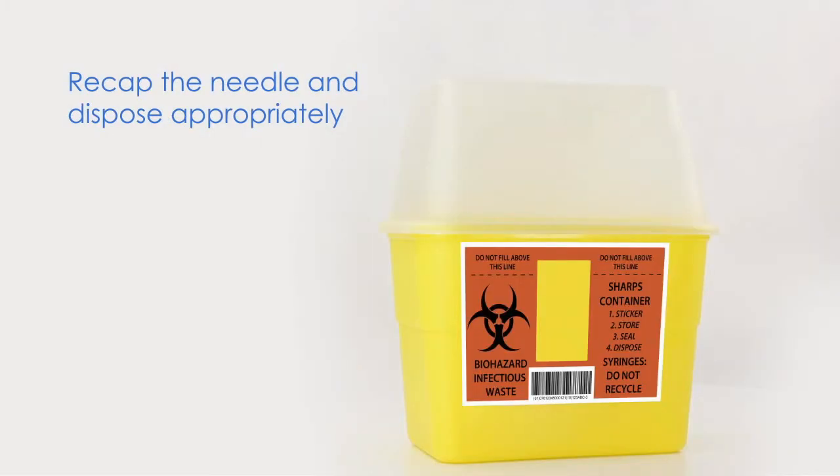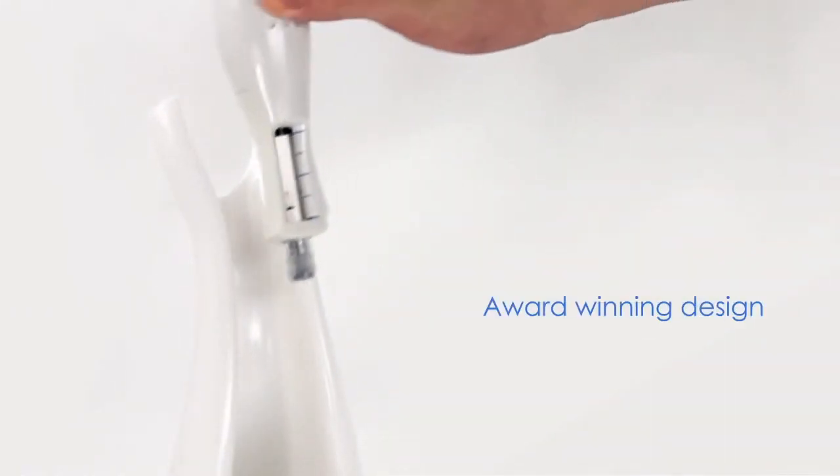Following the conclusion of treatment, recap the needle shield and dispose of the device in an appropriate sharps container.